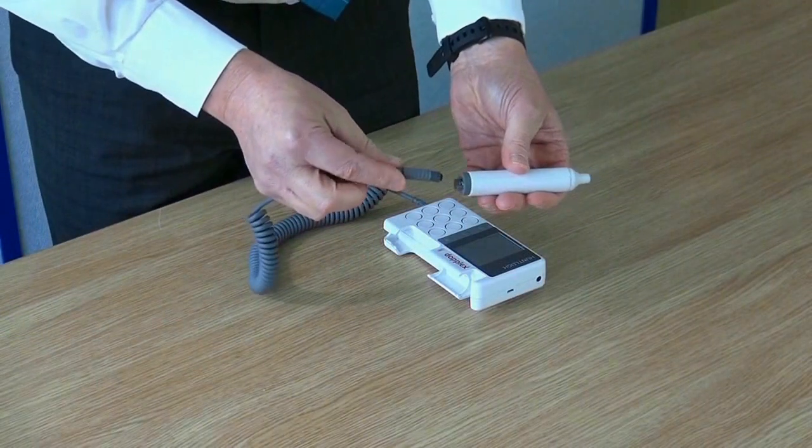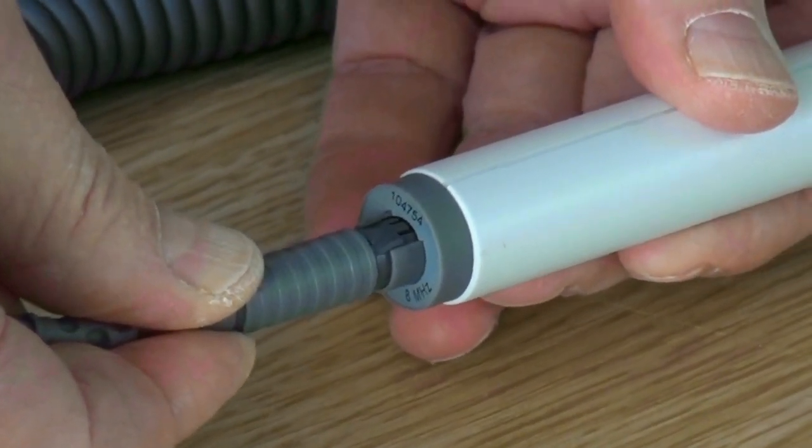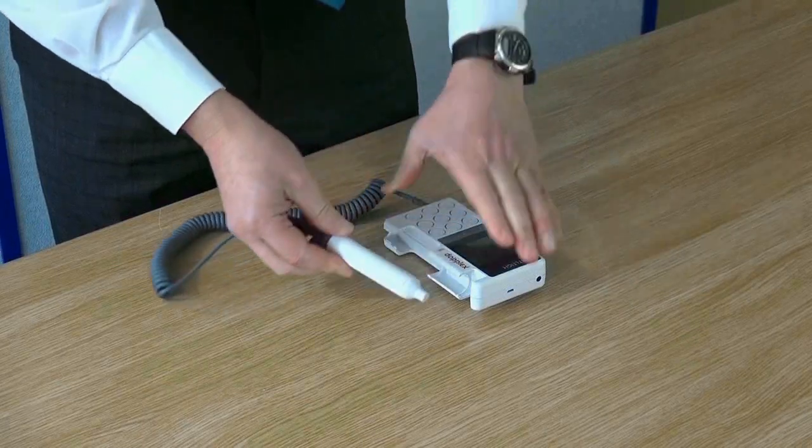Align the connector to the bottom of the probe and rotate until you feel the key system connect. Then push the connector into the probe.